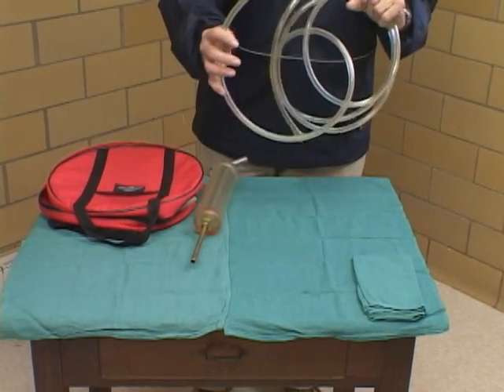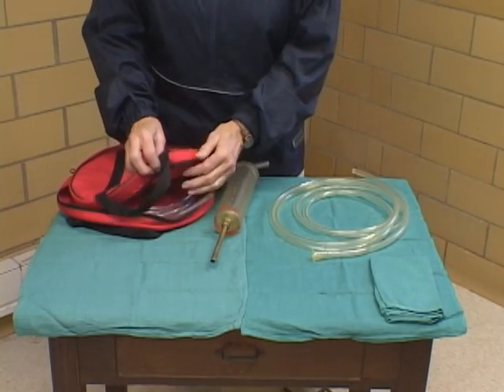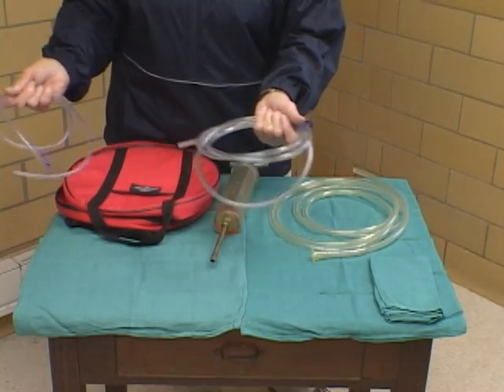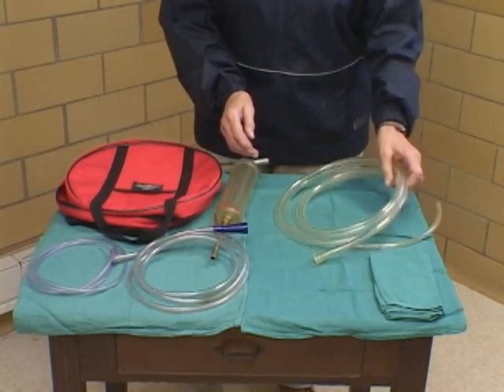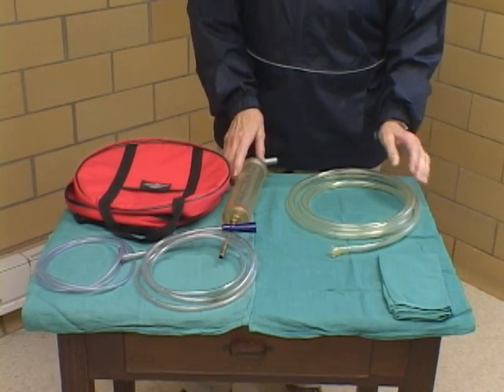Tubes come in a variety of sizes and diameters — there are about five or six altogether. These are showing you a variety of the smaller types of tubes. This would be a type of tube you would use with a newborn foal, for instance, and it goes up to sizes that are about twice the diameter of the tube we have here.